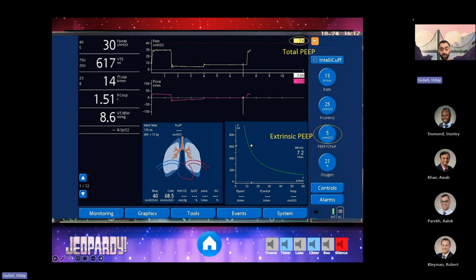And then obviously you want to fix this. A couple ways you can fix this. You can do the opposite: you can decrease the respiratory rate. That's the one I found to be most effective. You can reduce the tidal volume, or you can increase the expiratory time by adjusting the I to E ratio. That should allow for complete exhalation and thereby reduce air trapping.